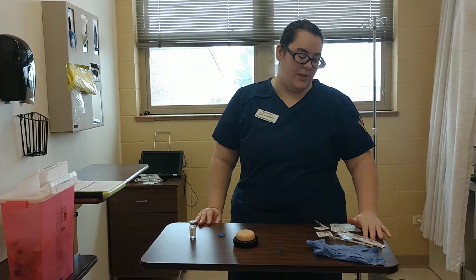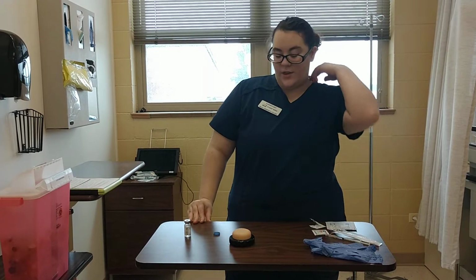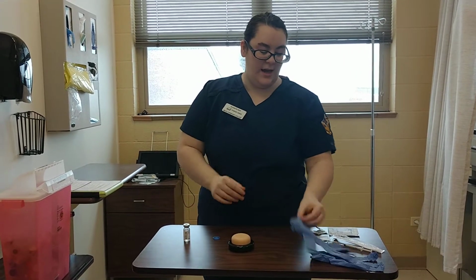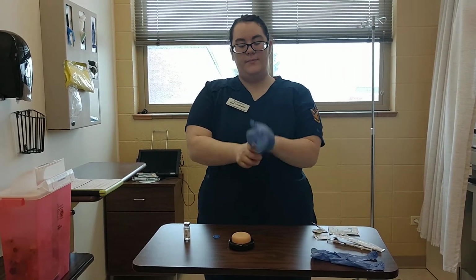I'm going to explain the procedure and the medication to the patient, and I'm going to identify the correct site for administering the medication and then position the patient. I'm going to wash my hands, and I'm going to put on gloves.